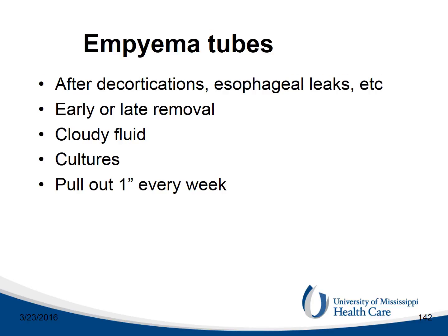The term empyema tube refers to a chest tube left for a prolonged amount of time, usually after an empyema, a decortication, and still having purulent drainage and/or a prolonged air leak. A positive culture of the drainage may indicate the need for an empyema tube. The tube can be connected to a unidirectional valve and a bag, or left open to air if there are adhesions of the lung to the chest wall.